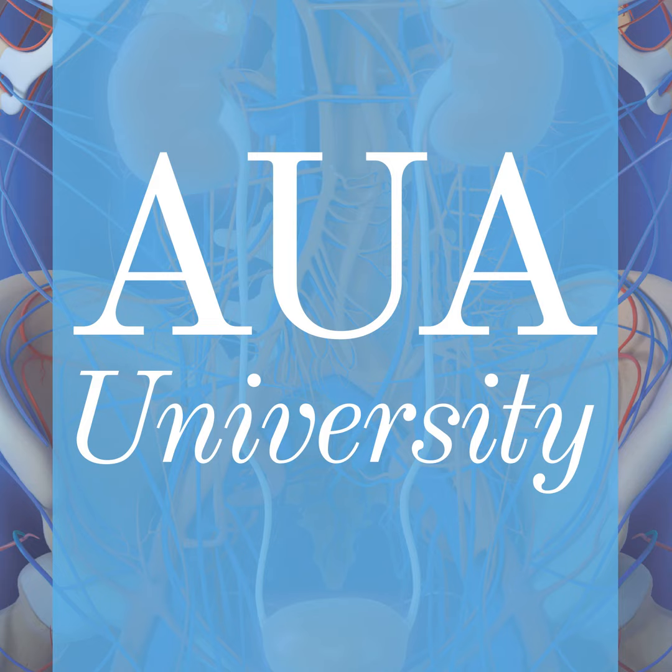What you always have to consider is that PSMA is not prostate cancer specific. So there is always the danger or the possibility that you have false positive results. You have to remember that there is a physiological expression of PSMA in the kidney, in the salivary glands, and also in the small intestine, the liver, and the spleen. So whenever you see PSMA-avid lesions in those areas, you always have to think about the possibility of false positive results before you start any type of treatment.